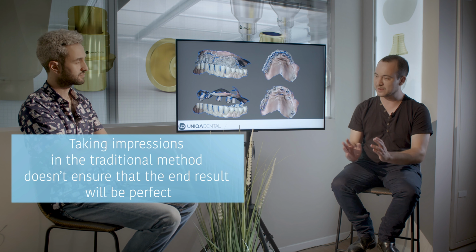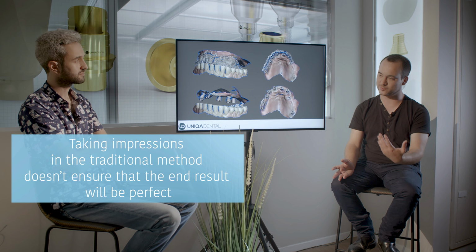And the next time when you check it, you already have crowns. You can't be sure that the end result, the end crowns, will be similar to the relations you got. In here, everything is in your hands. You can see it right away, and you know if what you got is the same as what's in the mouth.